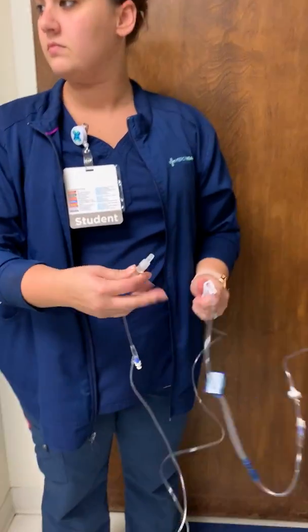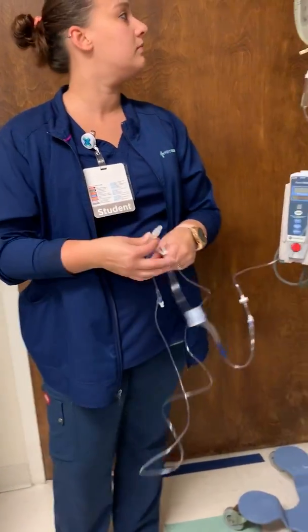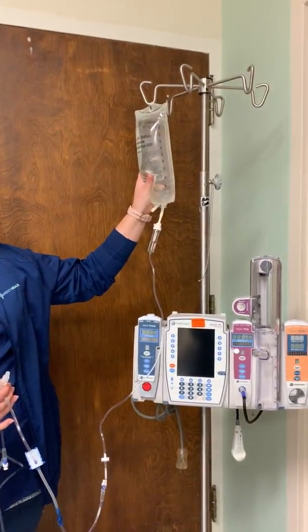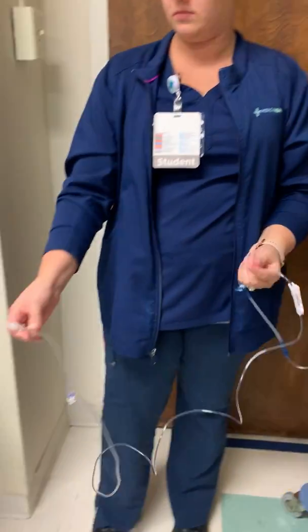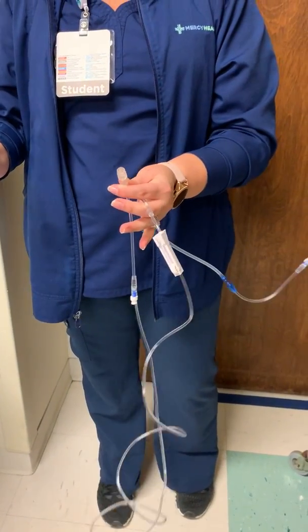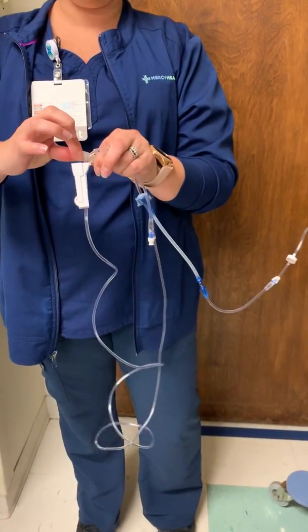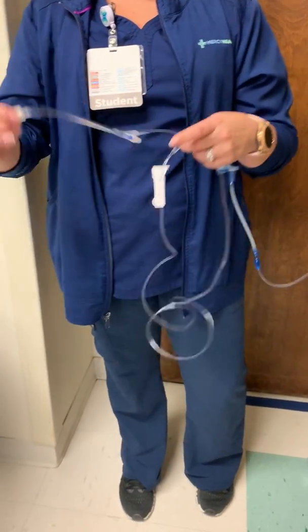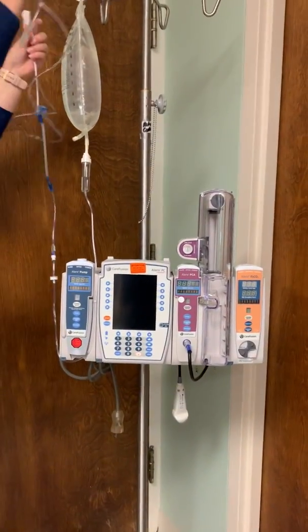What about if the patient already has primary fluid running? Ensure the compatibility of the fluid with the pain medicine first, and then disconnect the primary IV tubing from the pump and the patient's site, leaving the blue PRN adapter attached, and make sure you cap the IV tubing to maintain sterility. Of course, you'll flush the blue PRN adapter as well.